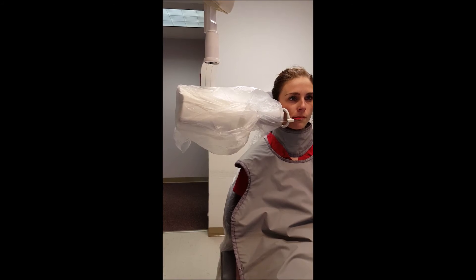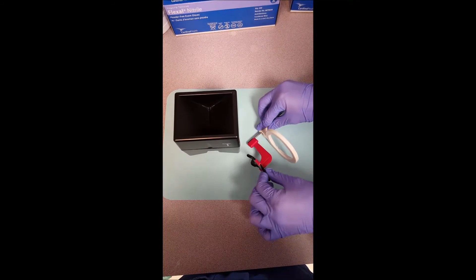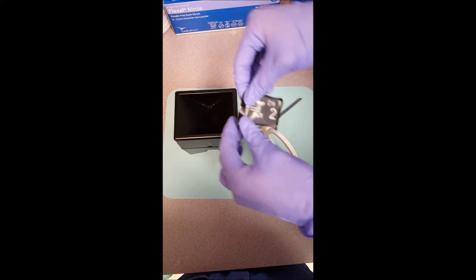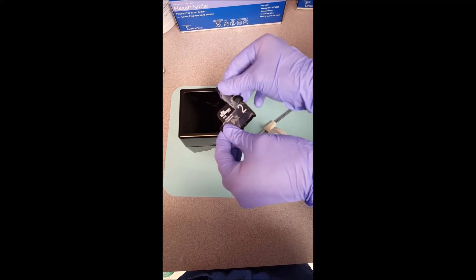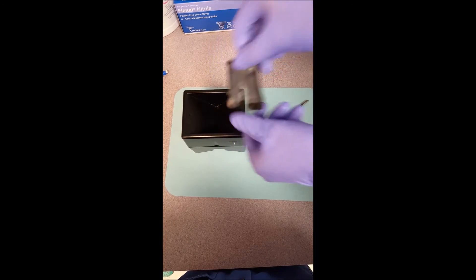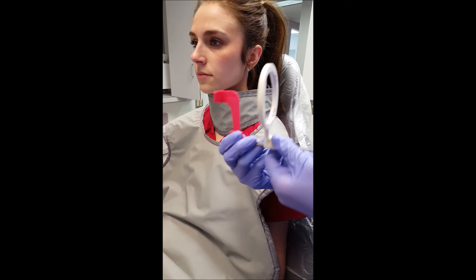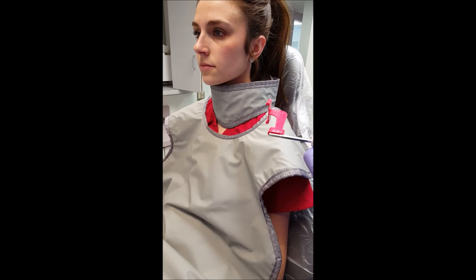Remove the device from the patient's mouth and remove the phosphor plate. Again, remove the protective barrier and place the phosphor plate in the film box blue side down. Adjust the instrument by flipping it and repeating the procedure on the opposite side of the mouth.